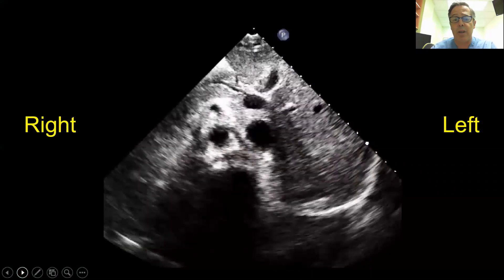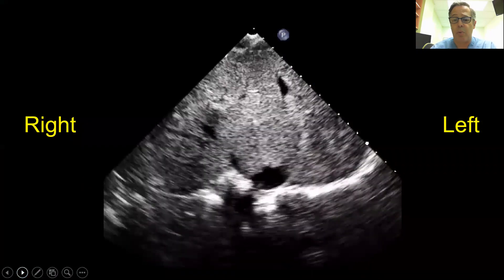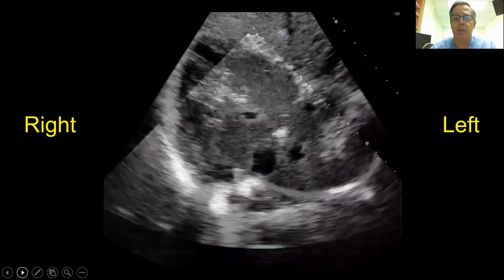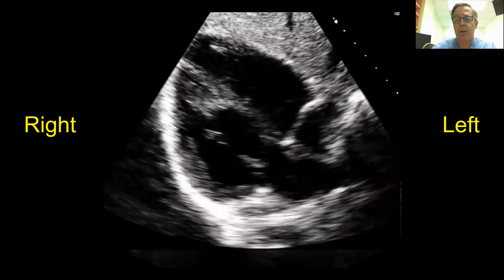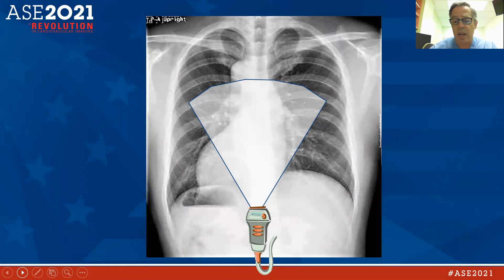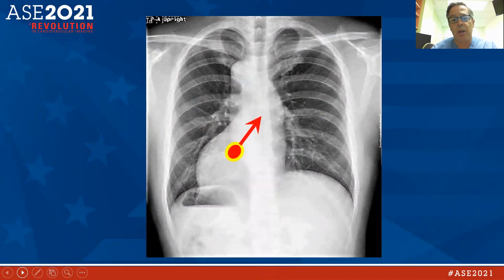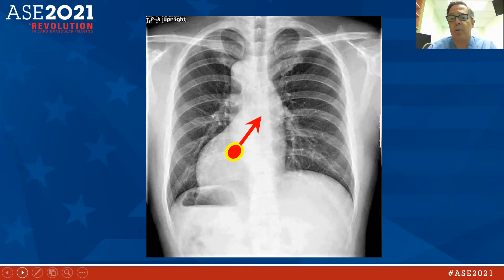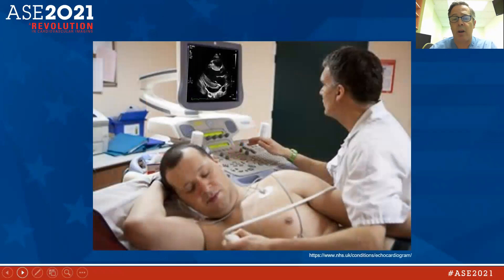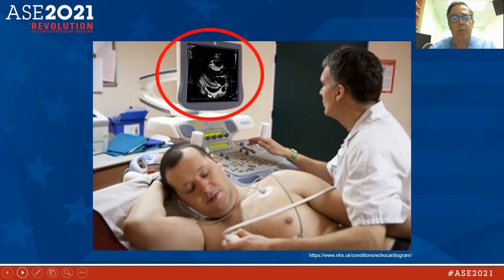As we scan up into the chest with the marker pointed to the left in the typical orientation, we see that the heart is to the right with the apex to the right — dextrocardia. Knowing the heart is on the right, we can formulate our approach: place the probe on the right parasternal, right next to the sternum opposite of where we'd place it for a left parasternal view, and have the patient up on their right lateral decubitus, which should give us the typical views we're looking for.